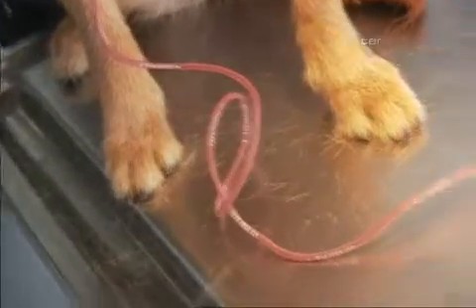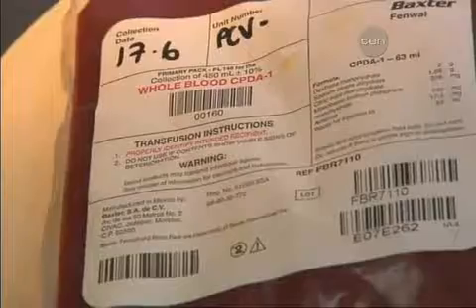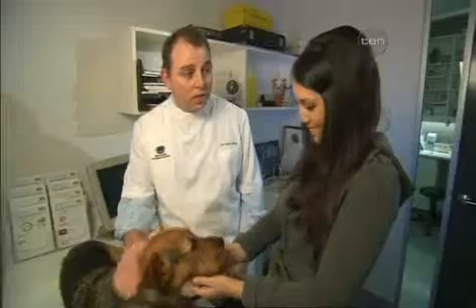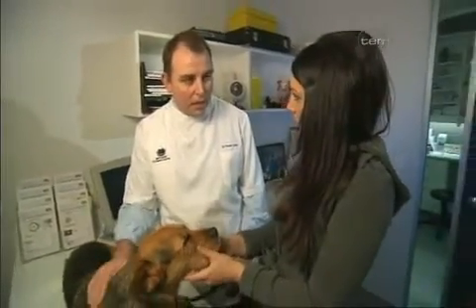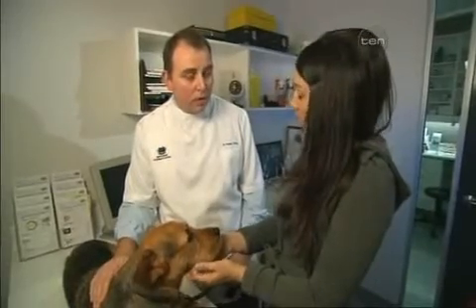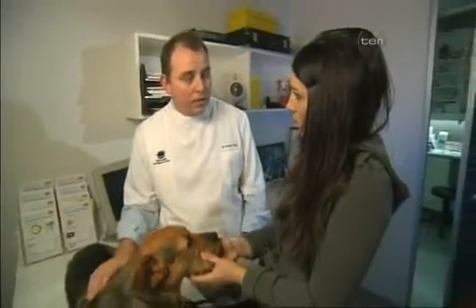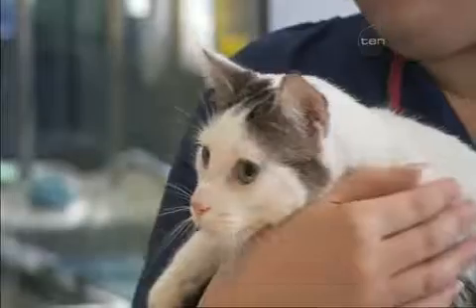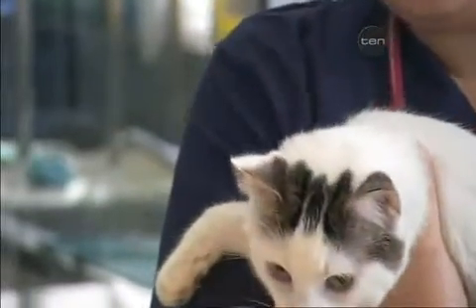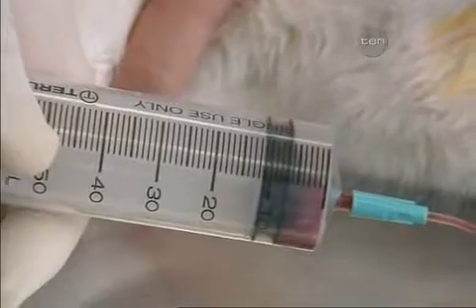Now, dogs and cats, they're quite small in stature, so being mindful of that, how much blood can you actually take from them? Okay, depends on the size of the pet. Zinzi's about 20 kilos, so we can take about 400 mils of blood from her. The actual blood collection bags are about the same as that they use for people, and they collect about 450. So even a large dog, we can get 450 mils of blood off them. The cats are a bit different, obviously, because they're all small, and we can probably get about 60 mils of blood from your average moggy.